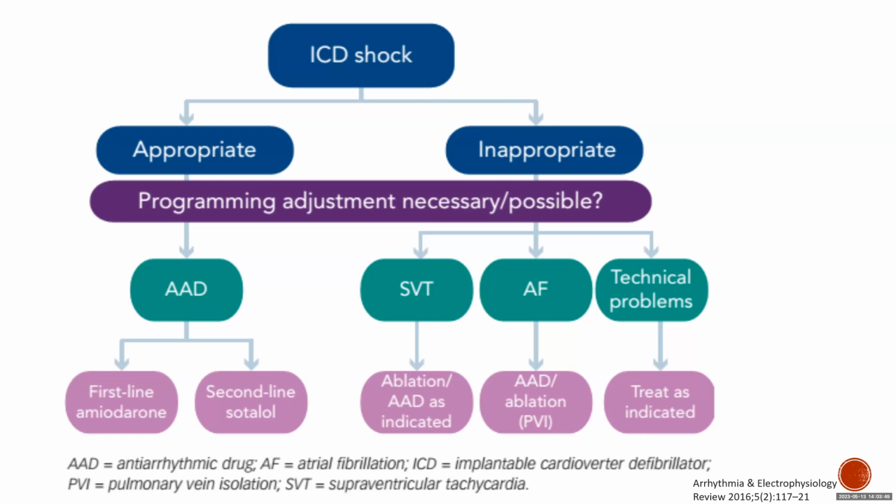If it's ICD, it will inhibit shocks. It will ask the device not to give any shocks. And then you manage the patient as if there is no ICD, like you manage any VT in the CCU or in the emergency room. So can you give shock? Absolutely. You can ignore the presence of ICD.